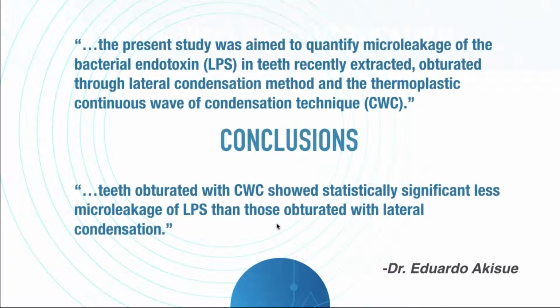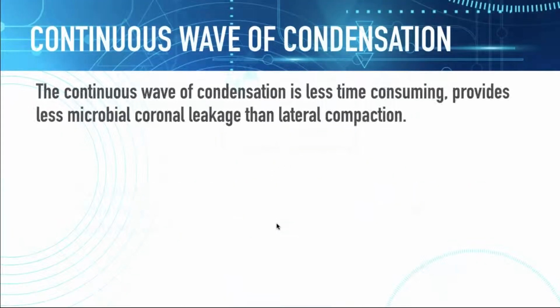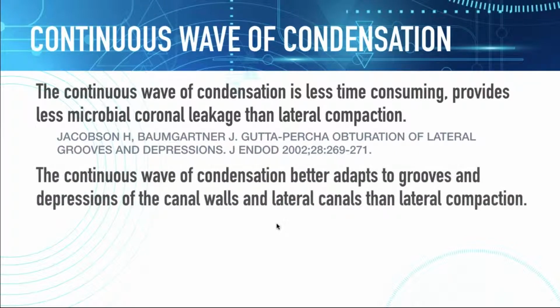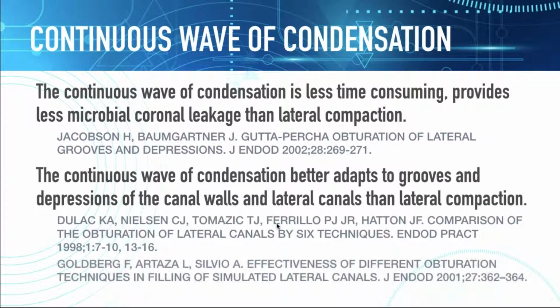So the proof is in the pudding, and there's lots of studies that will show this: it's less time consuming. It provides less microbial coronal leakage than lateral compaction. In fact, it adapted better to the grooves and the depressions and all the intricacies of the root canal system than cold lateral compaction.